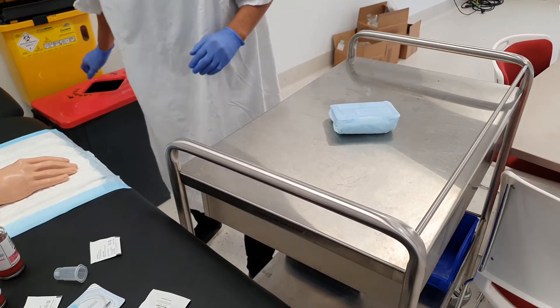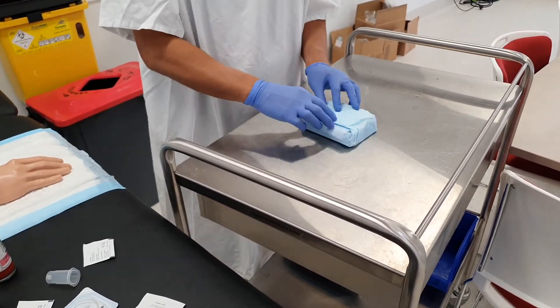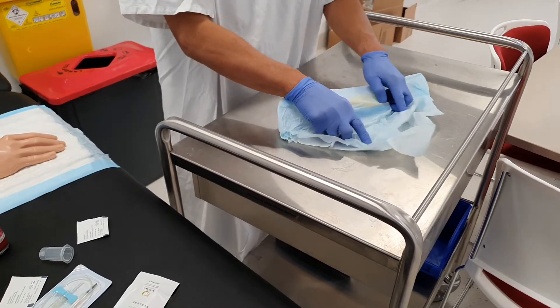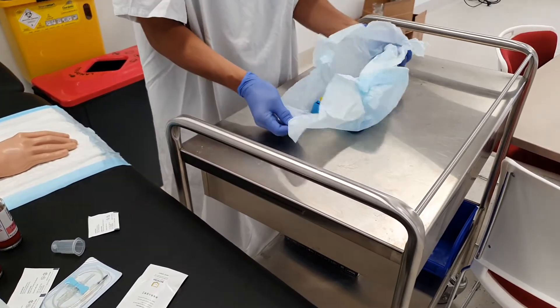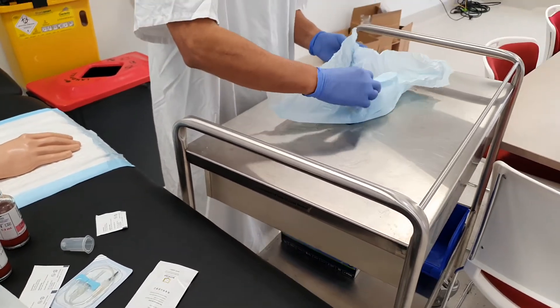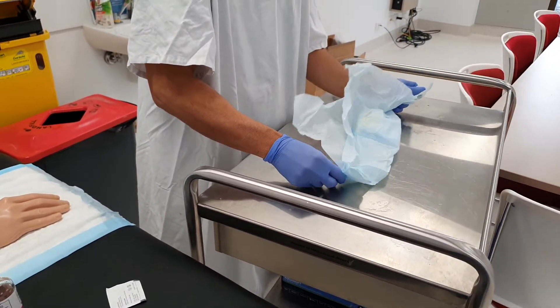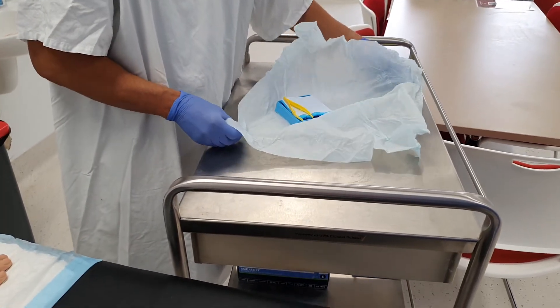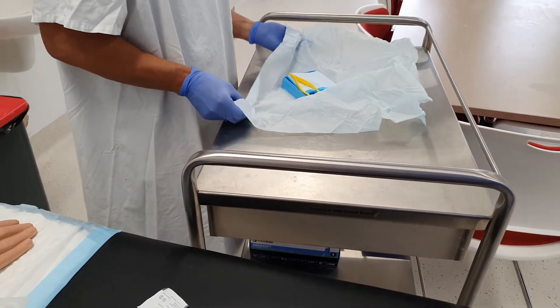It's okay to leave the tourniquet on the patient as long as you can palpate a radial artery. In fact, the tourniquet will be doing its job — taking all that arterial blood as it passes through the tissues and turns into venous blood on the way back, where the tourniquet will start to engorge the veins, making it hopefully easier to take some blood.